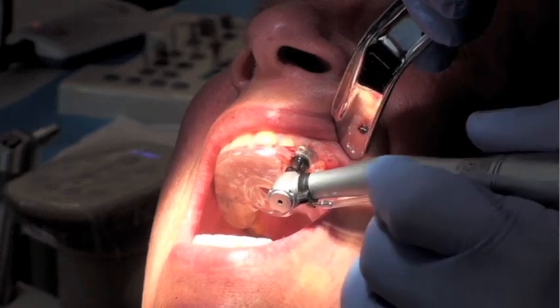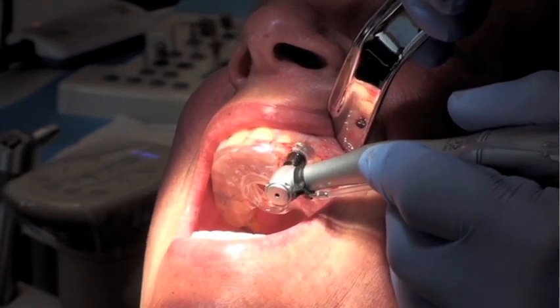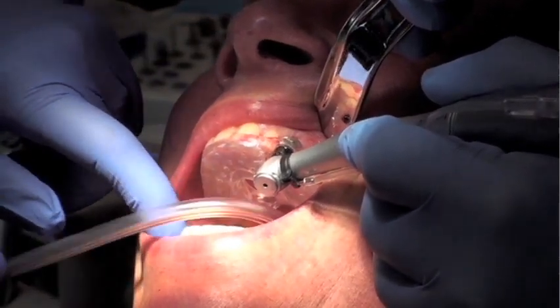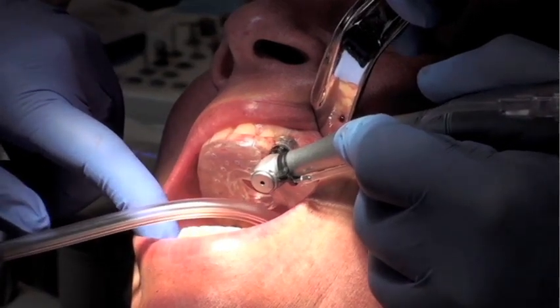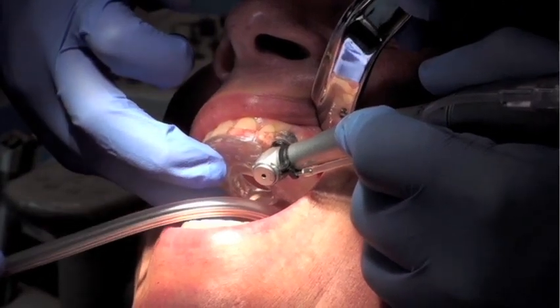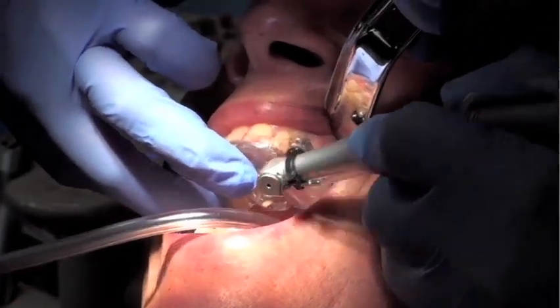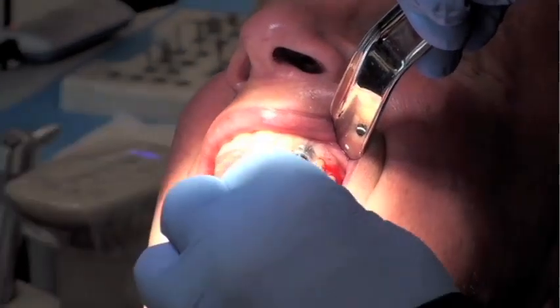There is a stopper built into the implant holder. Once the implant has been placed to the perfect depth, there's a quick release that allows me to disengage the handpiece from the implant complex. At this point, I can unscrew the implant holder from the implant.